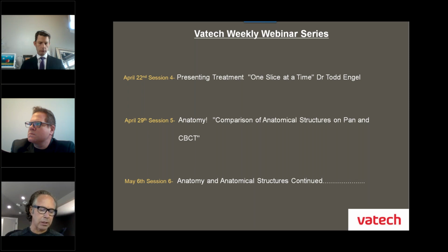Take a breath and look at 3D as something that's going to give you yet another arm to work with and another tongue to communicate with. And just take it in steps. And if you come to the 22nd, that would be great, because one of the things I came up with a long time ago was 5 clicks to yes. We're going to call it one slice at a time.